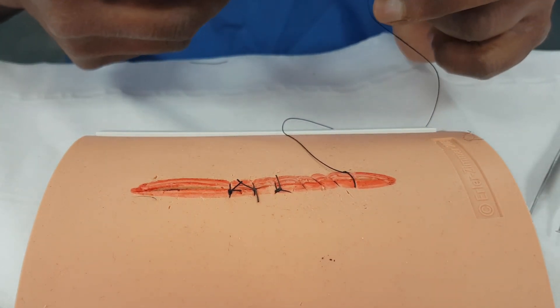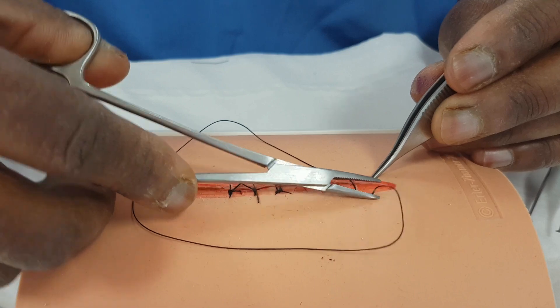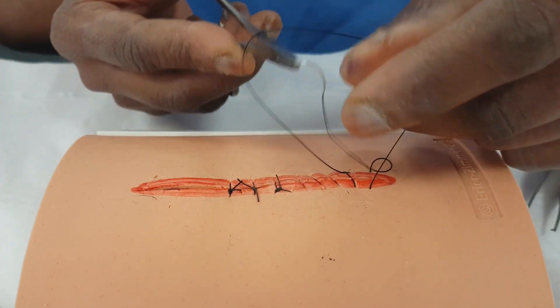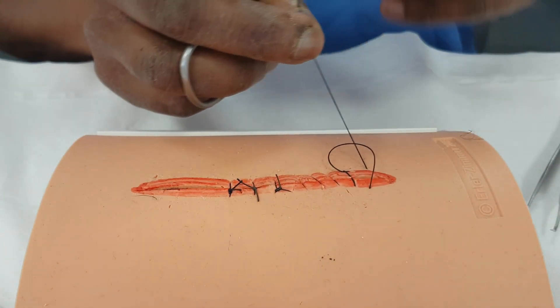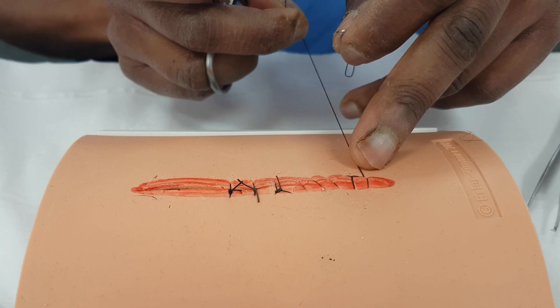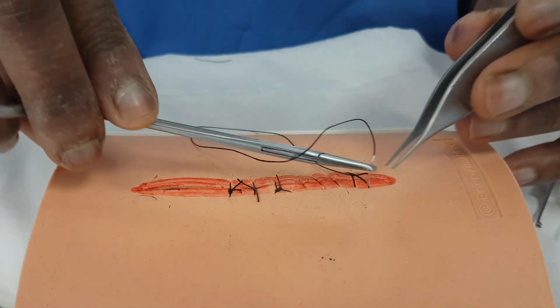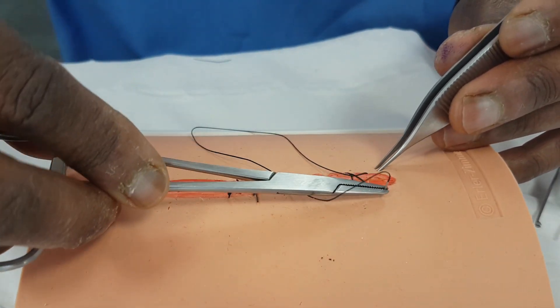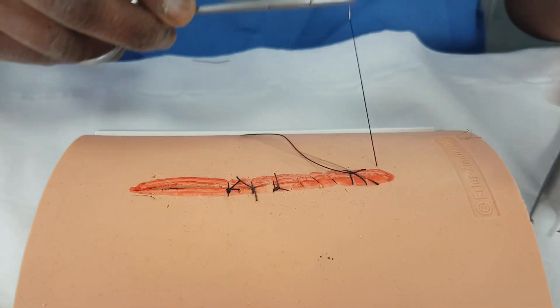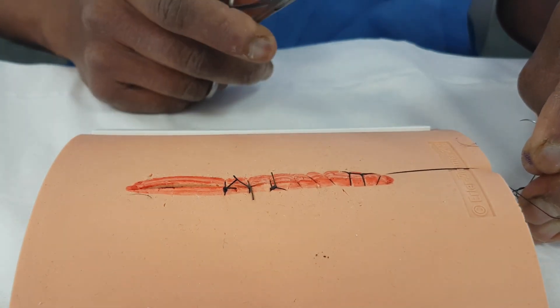I can show you something even more funky than that in a minute. I'll just do that again for you for the camera. We're going through the wound, and what we want to do is to lock it. This is a really good haemostatic stitch — some people call it a blanket stitch. You bring your stitch and bring it through the loop. As you then pull that down, watch what happens over here — can you see how it's locking the wound together? If I've got a wound edge like the scalp, which is very prone to bleeding, and it's very hard to stop bleeding from the edges because the scalp has so many layers that you want to try and close — this is a lovely stitch to bring through. You just simply get it through the middle, and as you pull it, you can see what's happening. It's closing it really nicely.